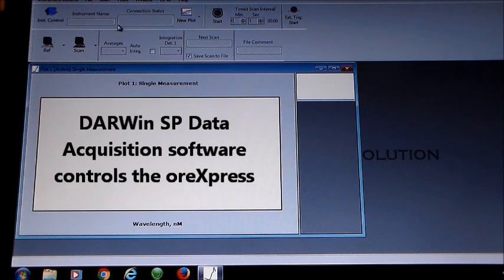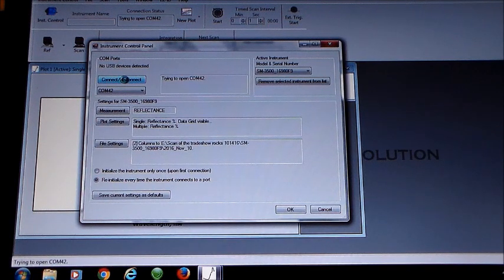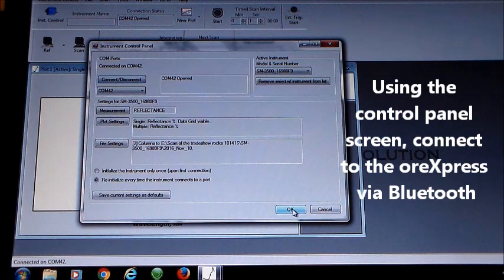Darwin SP data acquisition software controls the ORExpress. Darwin runs under the Windows operating system — Windows 7, 8, or 10 — on a laptop, desktop, or tablet. Using the instrument control panel, connect to the ORExpress using Bluetooth.